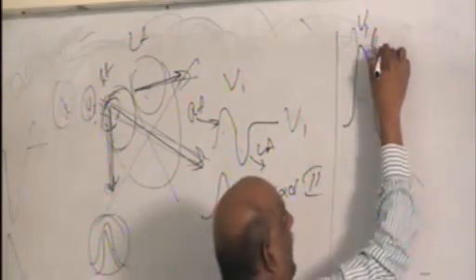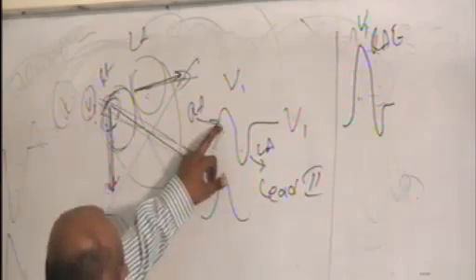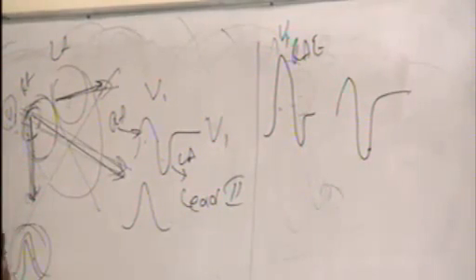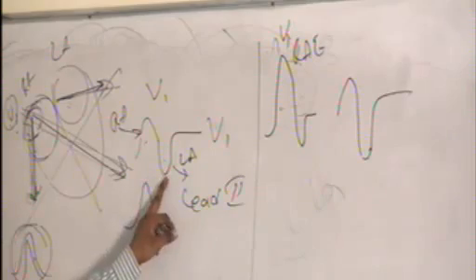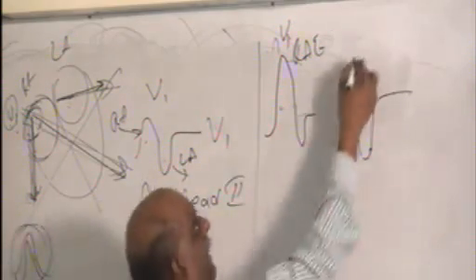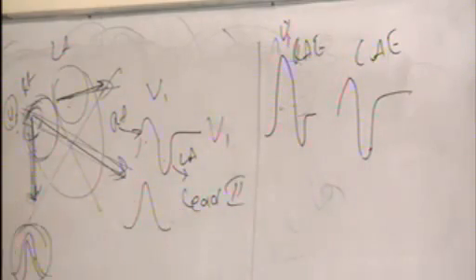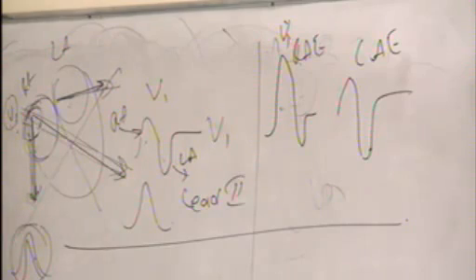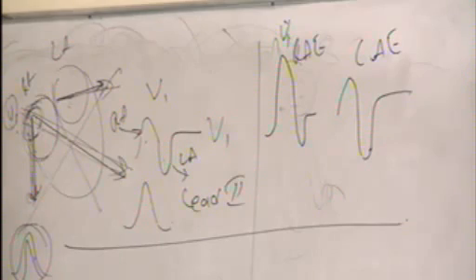If there is a left atrial enlargement, the initial positive remains the same, and what do you get? A significant negative deflection because of the left atrial activity. If there is a left atrial enlargement in V1, that is the story. In lead V1, how will right atrial enlargement and left atrial enlargement look?